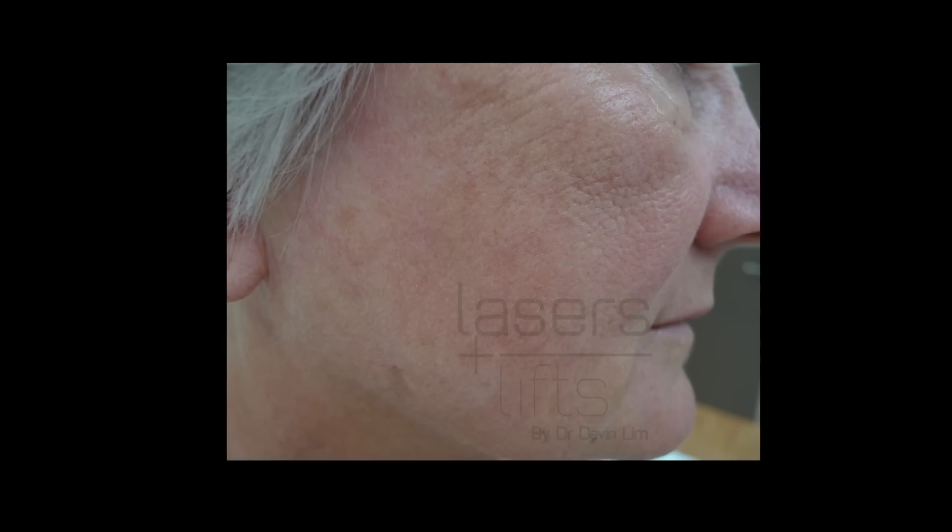Let's look at a few before and after photographs. This lady had an immense amount of seborrheic keratosis together with wrinkling, so I used the same procedure: an erbium laser coupled with a CO2 fractional laser. This is the end result — a marked improvement in the seborrheic keratosis but also tightening of the skin, and that's only one procedure.